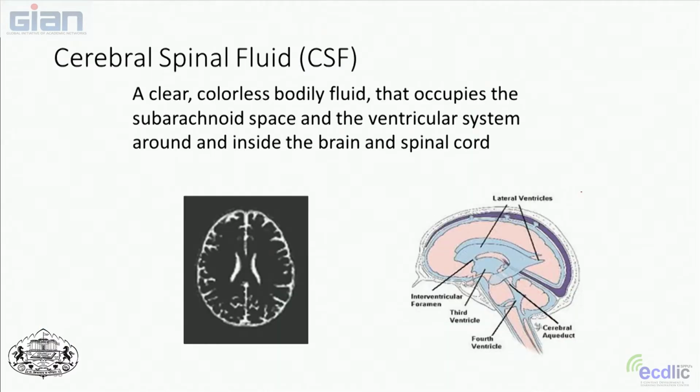Okay, this picture here at the bottom left is that same brain we showed you segmented into gray matter and white matter. This is the segmented part of the cerebral spinal fluid. So you can see, again, it's largely around the head and inside the head in these ventricular areas.